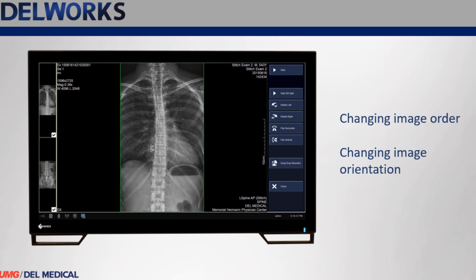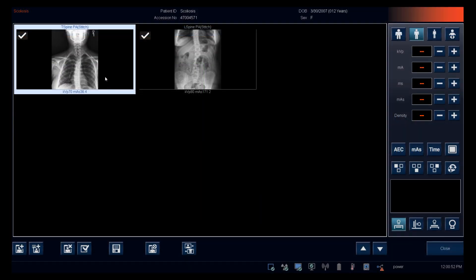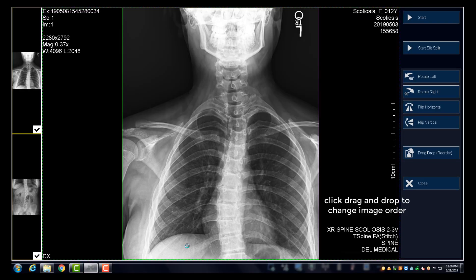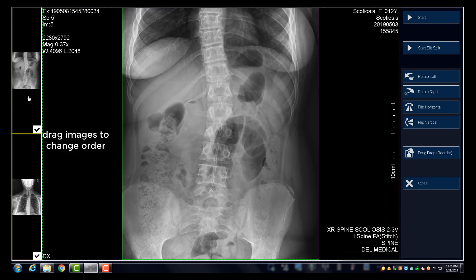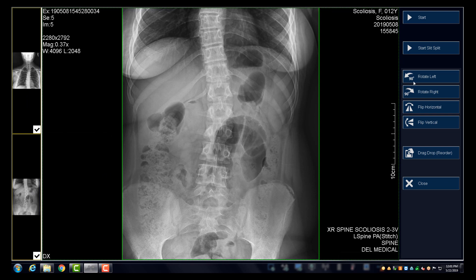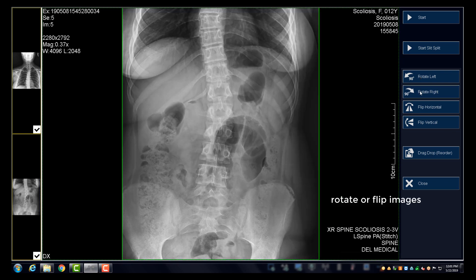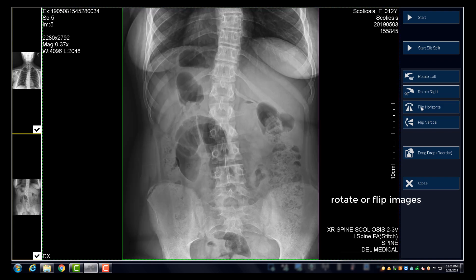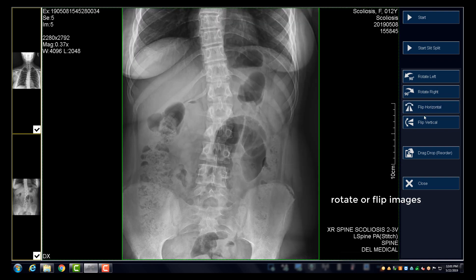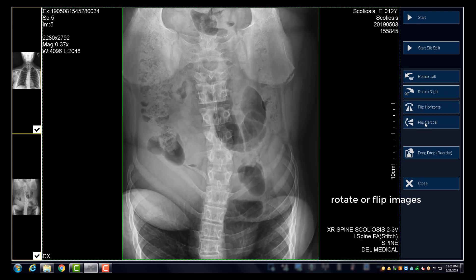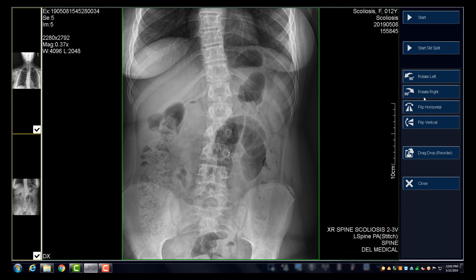Changing image order and orientation. Dell Works allows you to easily change the order and orientation of images prior to stitching. Click on the image and click the stitch icon, then click on the drag and drop or reorder button. Drag the images into the desired order. You can also change the orientation by rotating the image left or right, or flipping it horizontally or vertically. Once the orientation and order is correct, click Start to stitch the images.